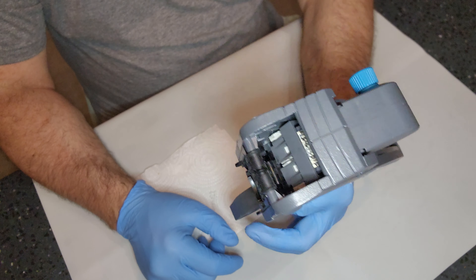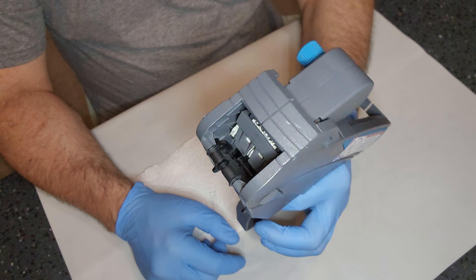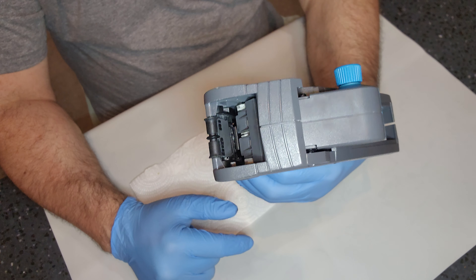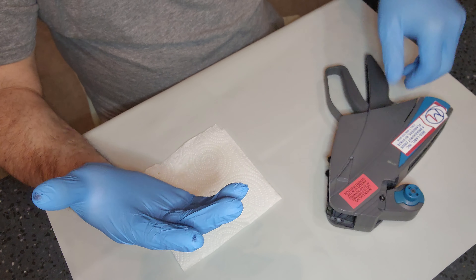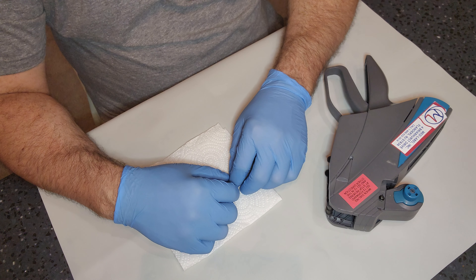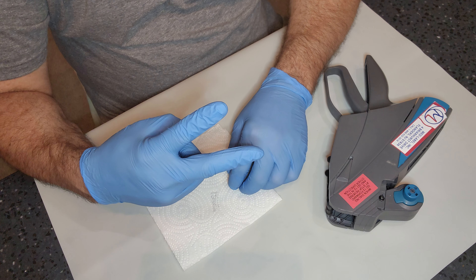Push that section back down all the way in, unlatch your door, and latch it back. Press your trigger — a couple little clicks — and that's it. The next thing you have to do is load your stickers, and you've just unloaded and loaded a brand new ink roll with minimal mess. As always, stay true to yourselves, keep it 100, continue educating yourself. Until next time, peace.